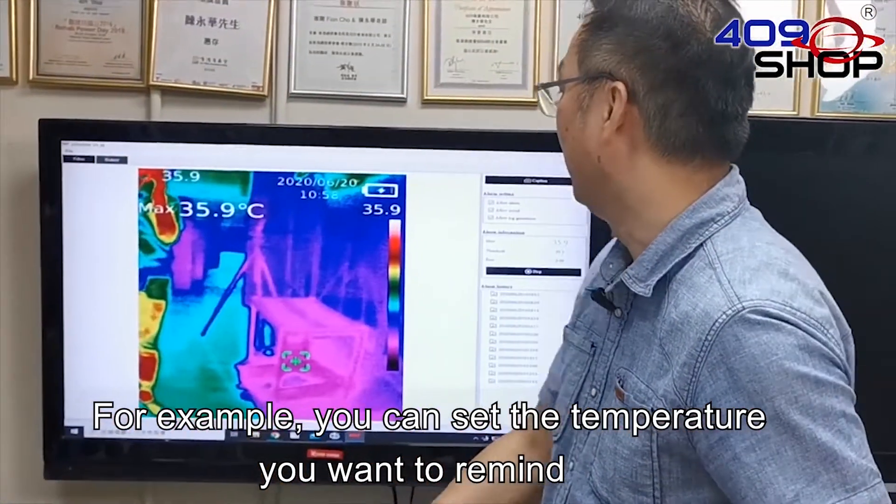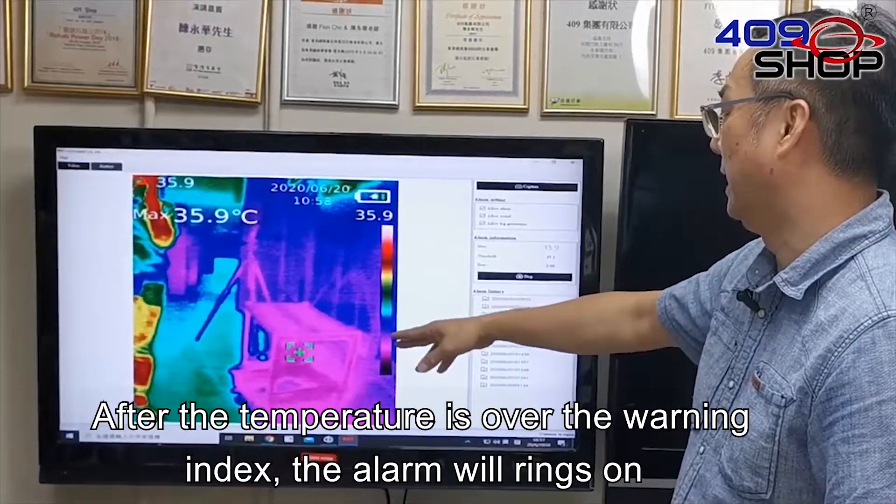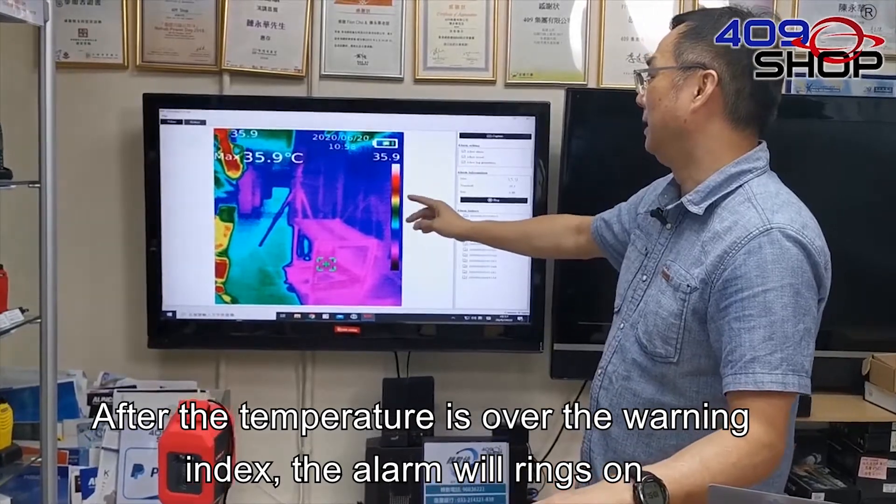For example, you can set the temperature you want to be reminded about. After the temperature is over the warning index, the alarm will ring.